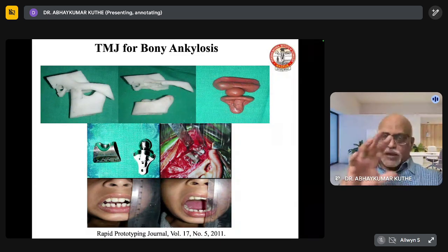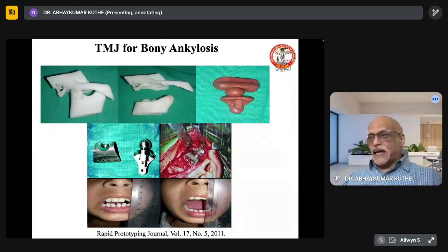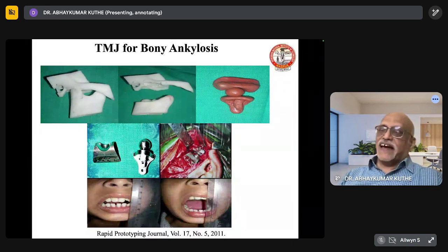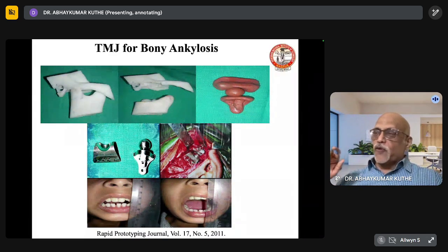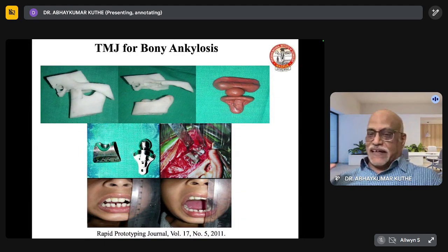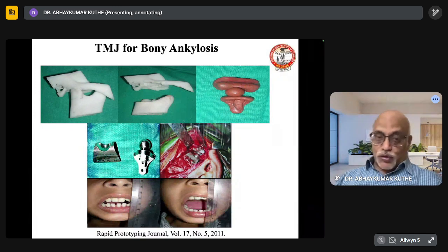All the details about the various steps that we have followed, you can very nicely read. I'm happy to tell you that the use of 3D printing in developing such customized metallic implants is the key. And remember here that had 3D printing not been there, it would not have been possible for the doctors to design the implant as they wish. And ultimately, it would not be possible to get the implant manufactured also, if 3D printing was not available. So this is all 3D printing.